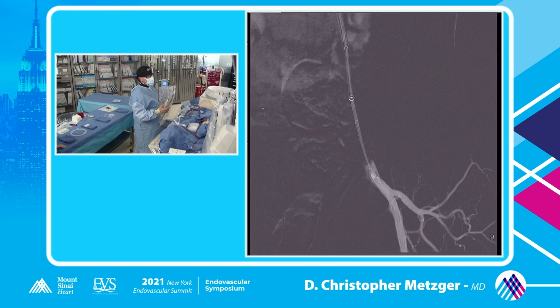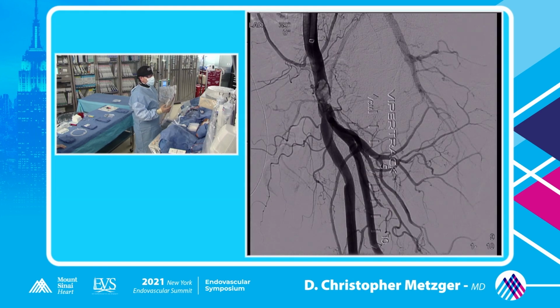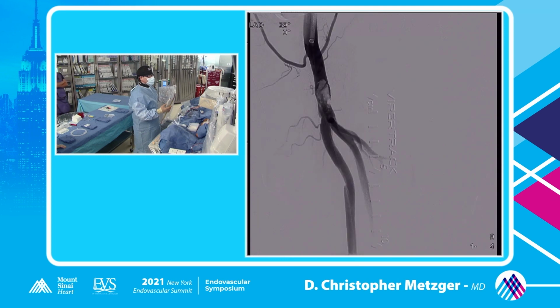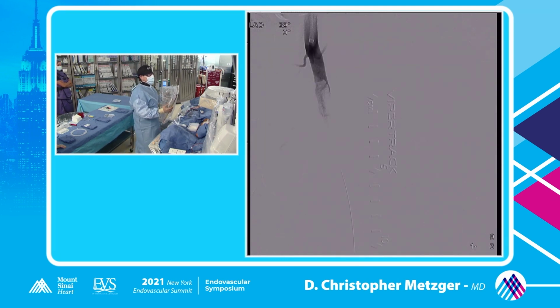And unfortunately, on my away game, our injector was broke, so they had to put through, we'll take a couple of just subtracted images. Let me just say that the SFA is very big. You can see it there. The SFA is not the problem. There's a densely calcified common femoral artery.